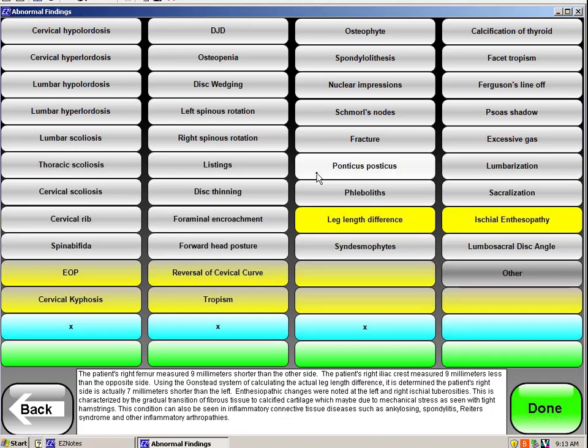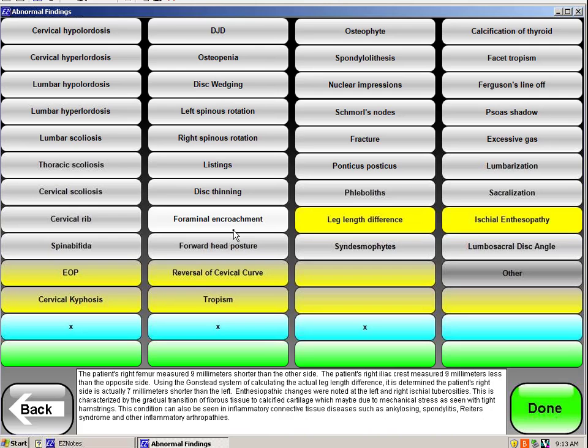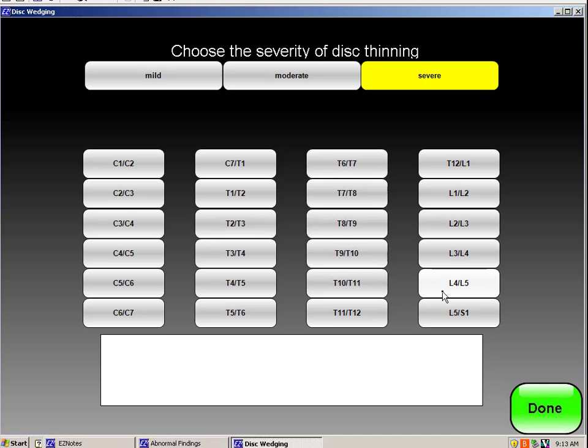Then if I said, well, let's look at any kind of degeneration. We have osteophytes. We have degenerative joint disease. Perhaps even like disc thinning on the lateral. Perhaps it was pretty severe. And you can pick the segment, L4-5. You get the idea.